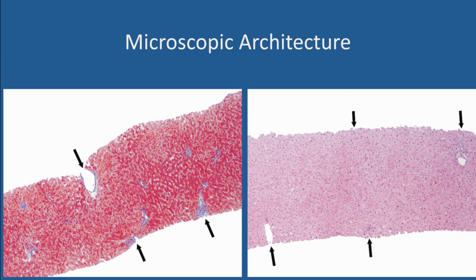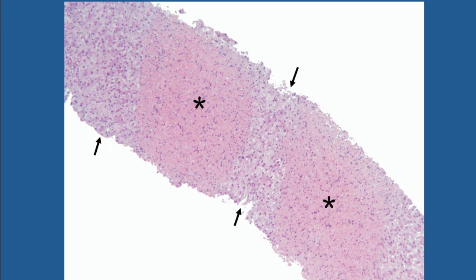By and large, when you look at a liver biopsy, it is a big sea of pink because the liver is basically made up of loads and loads of hepatocytes punctuated at regular intervals by portal tracts and central veins. Now, the zonation or the other structures of the liver do come into view in pathophysiological processes. For example, over here, we have an example of acetaminophen or Tylenol toxicity, and you see how it is a very zonal distribution.